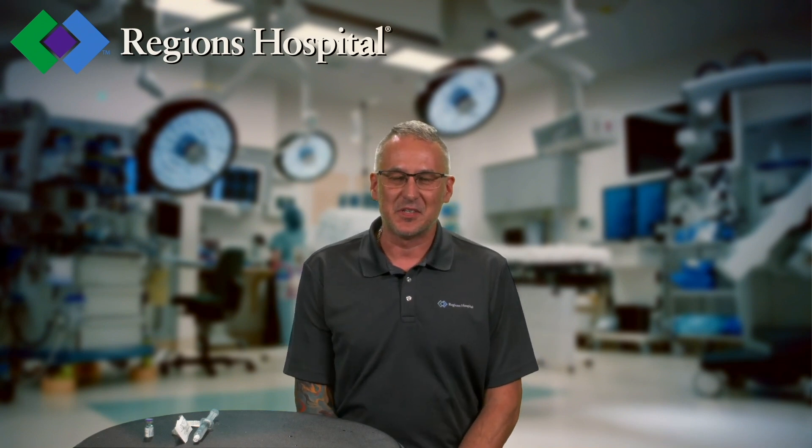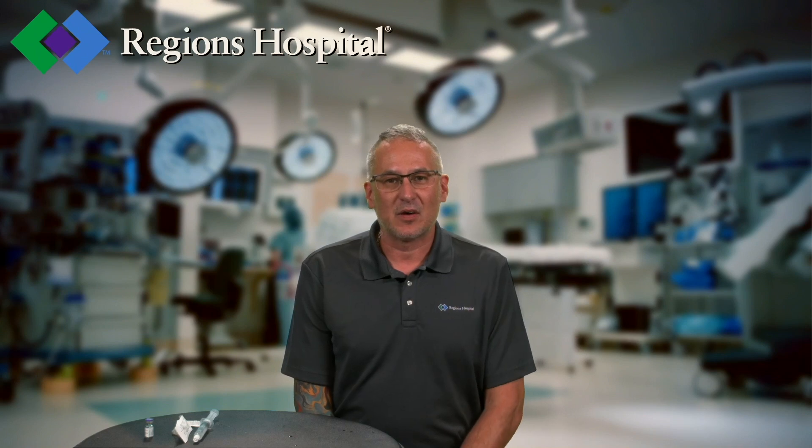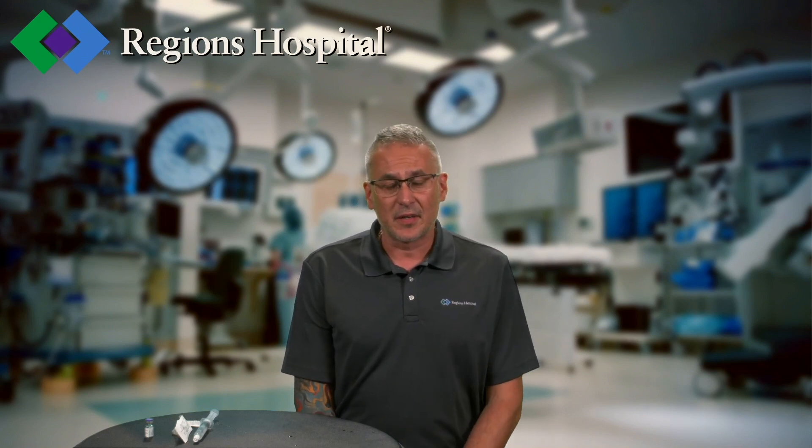Hi everybody, Jason with EMS Education, the ALS Educator. I'm going to be showing you how to make 1 to 10,000 epinephrine utilizing a 1 to 1,000 mix, because currently we're experiencing a shortage of 1 to 10,000.